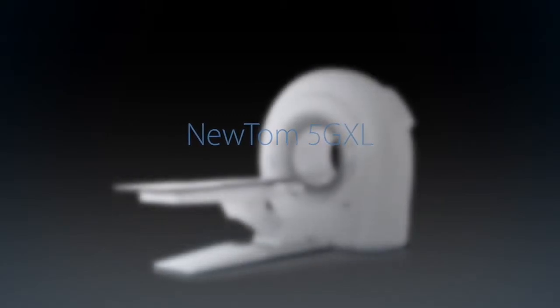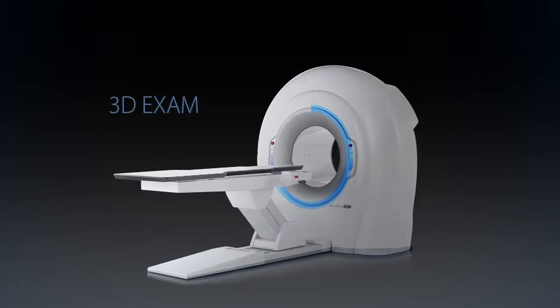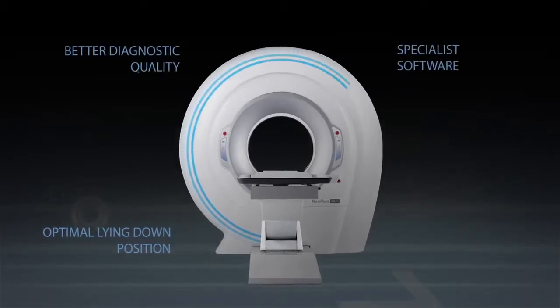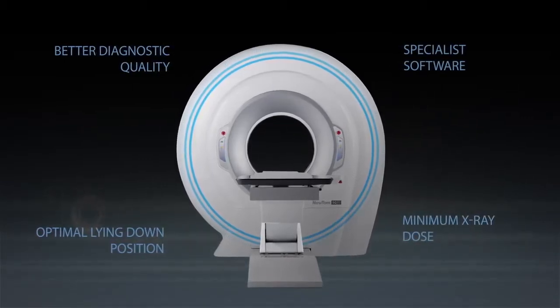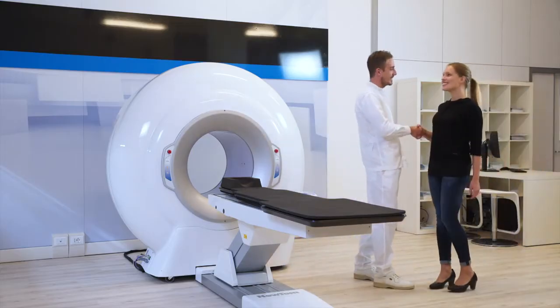NewTom 5G XL is the device that extends the very best CBCT technology to new fields of application. It is the only system with a motorized patient table that combines high diagnostic resolution with minimum patient exposure. Extra potential for radiologists and specialist physicians.